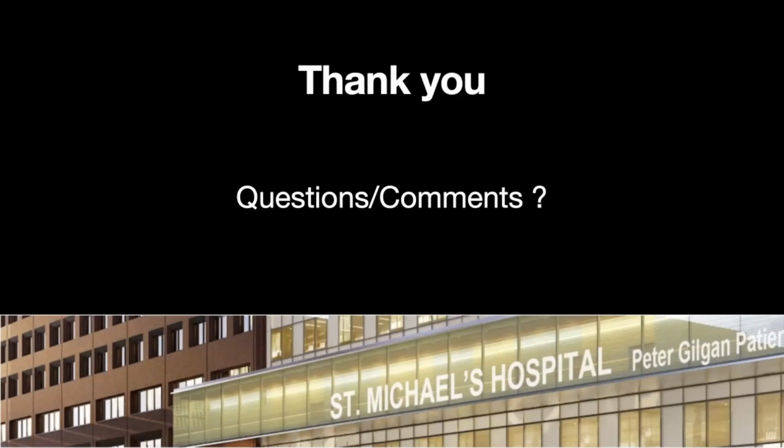The DVI actually allows you to compare studies from one to the other, and is very important in the prosthetic valve, because measuring the LVOT in the prosthetic valve is very challenging with all the shadowing. So I'm very happy that DVI, Doppler velocity index, has become more popular these days than when I first started.